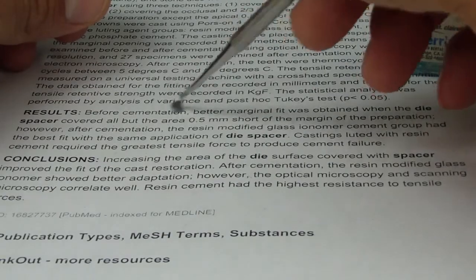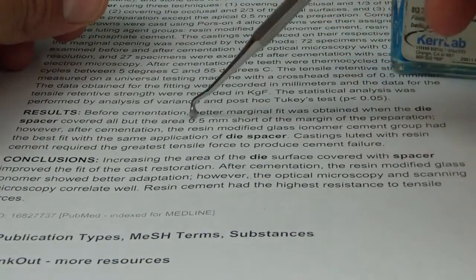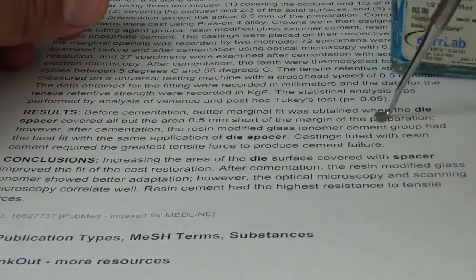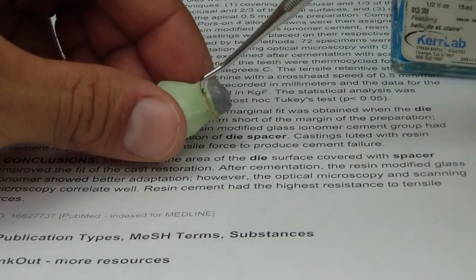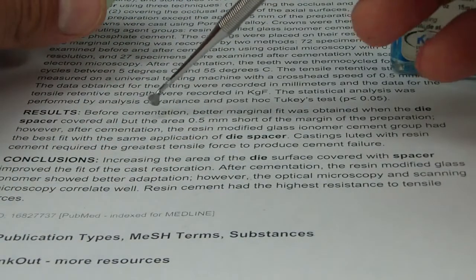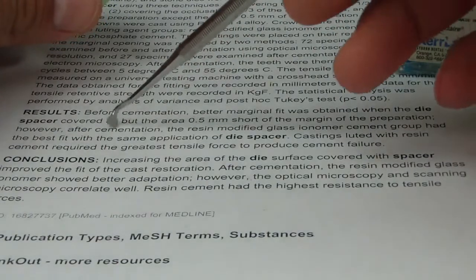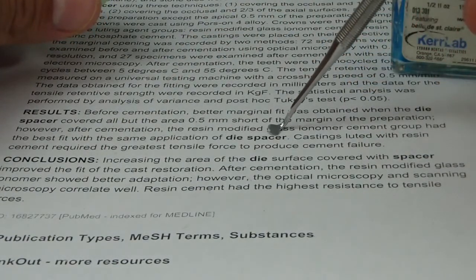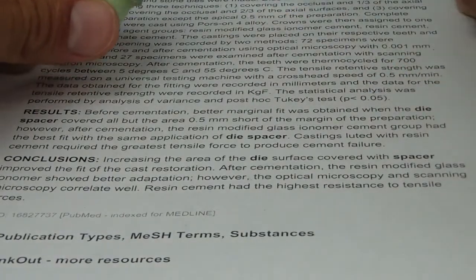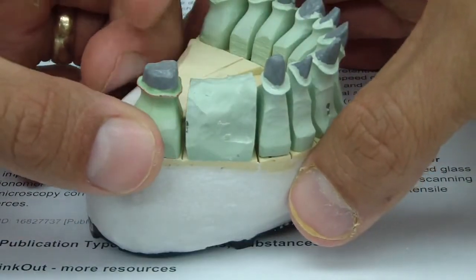They suggest that before cementation, better marginal fit was obtained when the die spacer covered all but 0.5 millimeters short of the margin of the preparation. However, after cementation, the resin-modified glass ionomer cement group had best fit with the same application of die spacer. So we're going to go with the 0.5 millimeter as the standard.